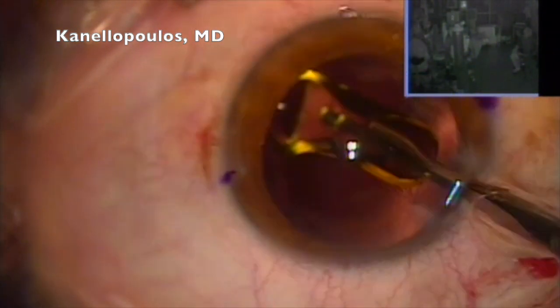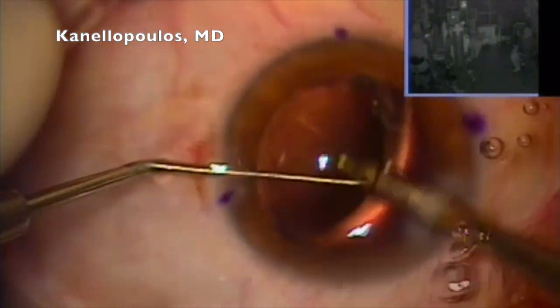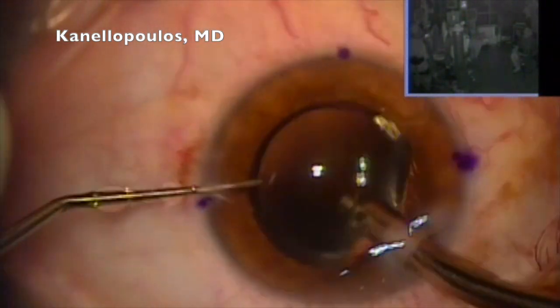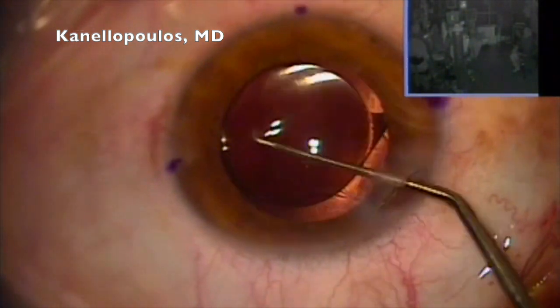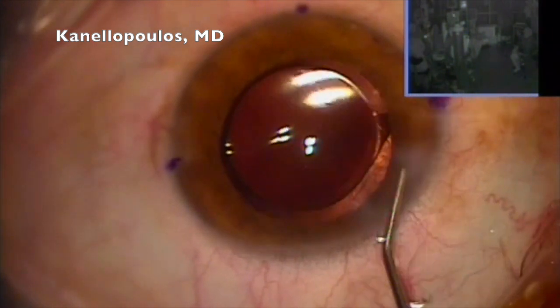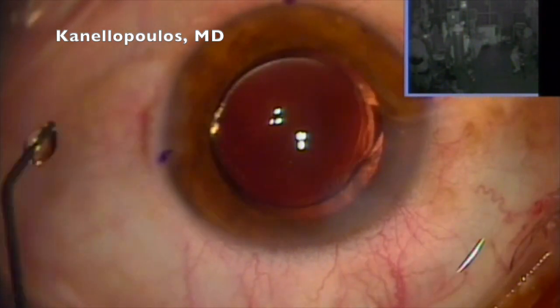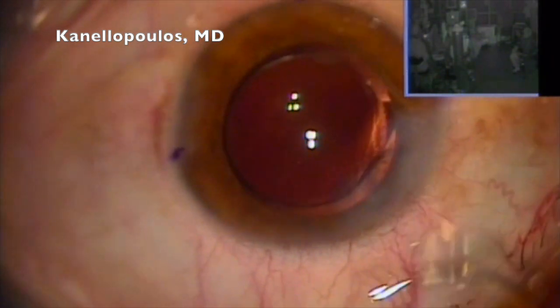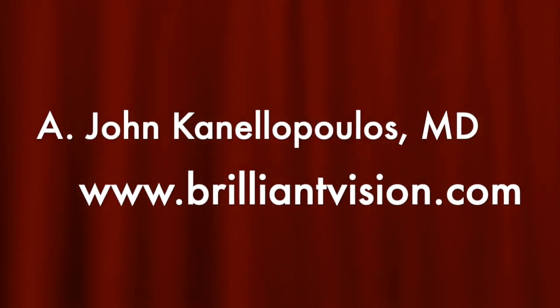He's 48. He'll be presbyopic in his other emmetropic eye. The minus 1/2 will help him in this eye to have very good distance vision and help with computer vision up until his mid-50s. I don't foresee his other eye undergoing cataract surgery anytime soon. So he'll probably be pseudophakic in one eye only. Procedure, again, same principles. You're seeing how meticulous I am with it, be watertight.